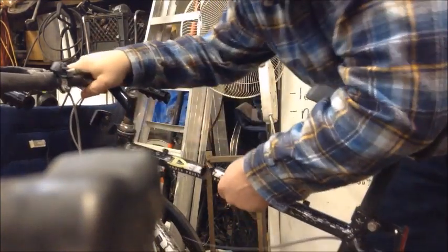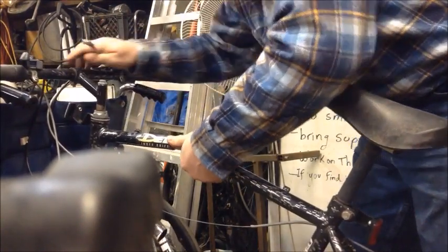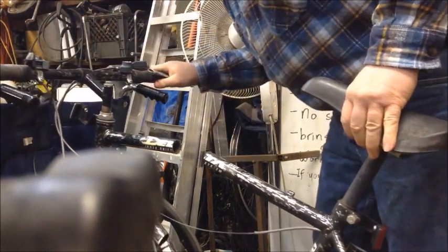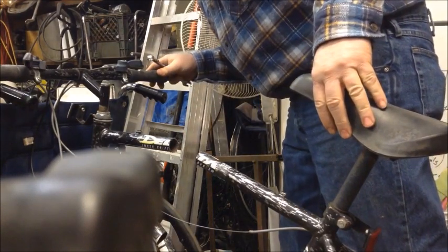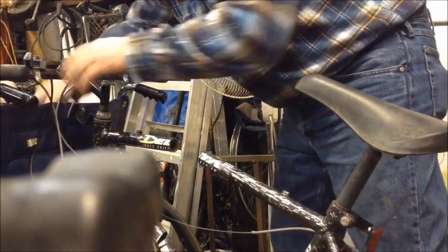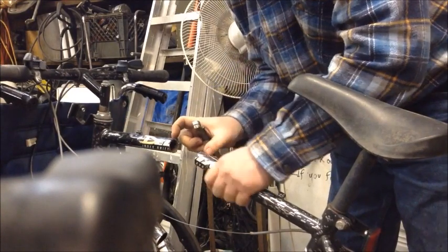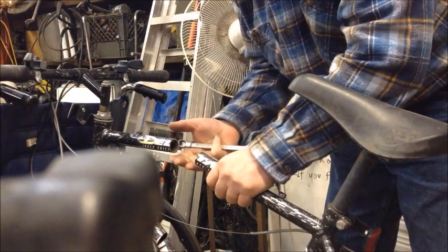Okay, so now we can splay that open. Good, so now we can see the headstock is about straight up and down. Just eyeball it, doesn't need to be perfect. But now we need to fill in material in this gap. Looks like this one's about 3 inches instead of 4. That's almost straight up and down. We'll reroute these cables behind here so they're not pushing into the back of this too. Heck, we might end up repositioning these handlebars too. It's easy to do. Nothing to it. Basic bicycle stuff. But we need to make ourselves a piece of material to go in between here. And we'll use the bender, and we'll get that bent to fit right in.